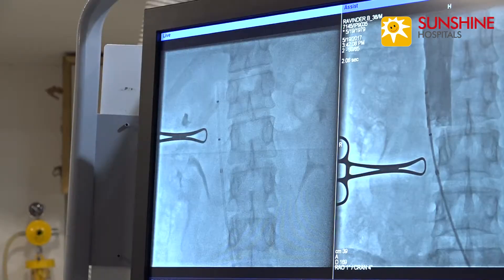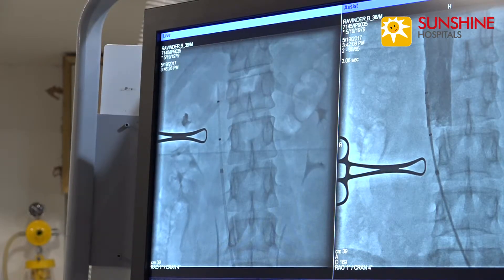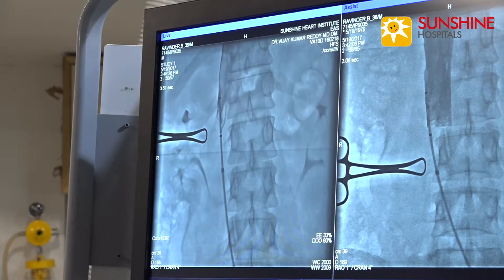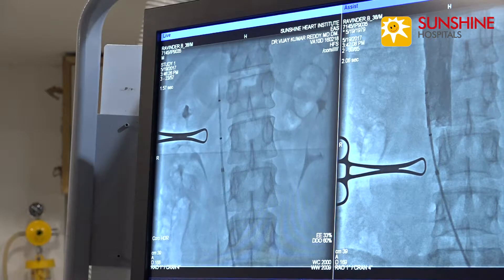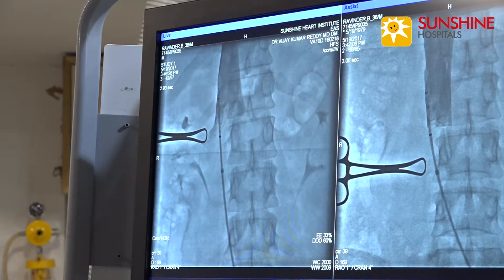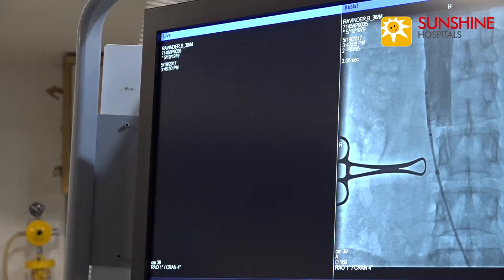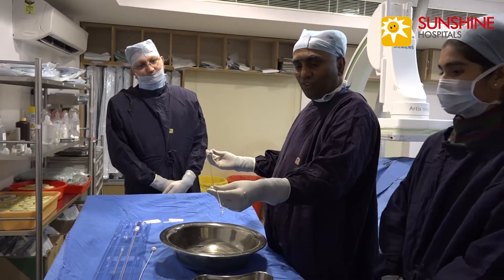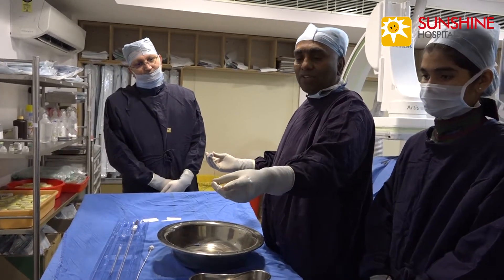Now we are doing an inferior venacavagram. We are able to see the renal veins just at the marker — this is in an ideal position. Select Platinum IVC filter. This is the IVC filter.